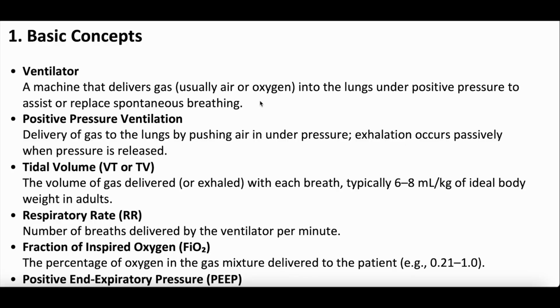So there's all that stuff with COVID about ventilators kill people, et cetera, but a ventilator is not meant to heal someone. A ventilator is we have no other option. You are going to die without this machine to keep you alive. And by putting you on this machine, we hope that it provides you with enough time to heal from your underlying illness.